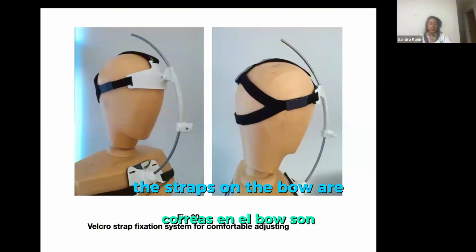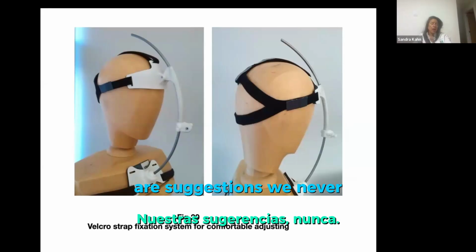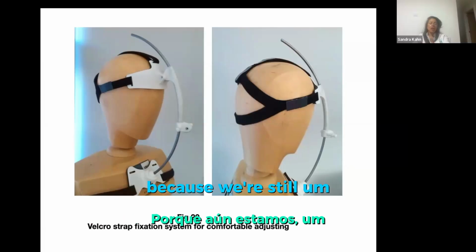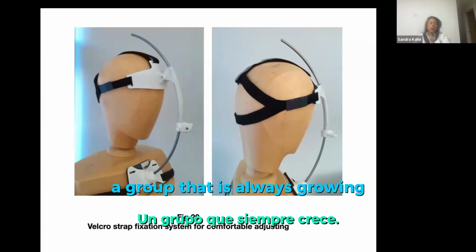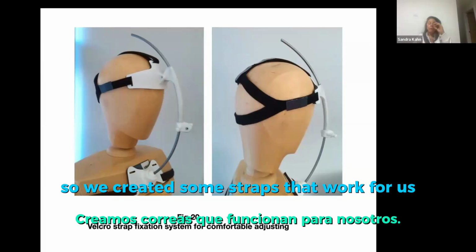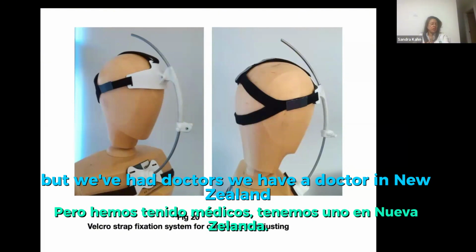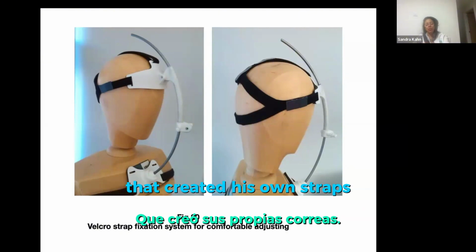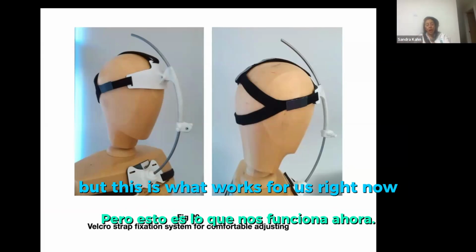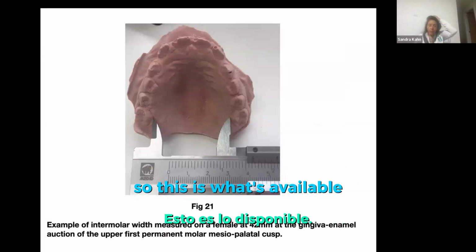The straps on the bow are suggestions. We never really designed the straps perfectly because this is a group that is always growing, always developing. So we created some straps that work for us. But we have a doctor in New Zealand that created his own straps. We have moms that sometimes sew their own straps, but this is what works for us right now. So this is what's available.